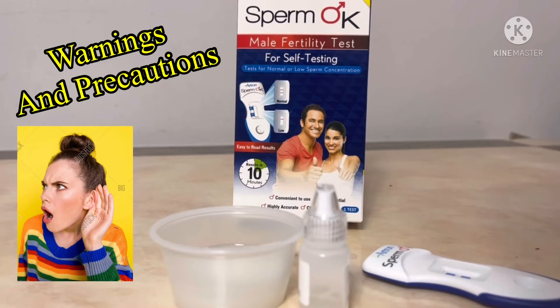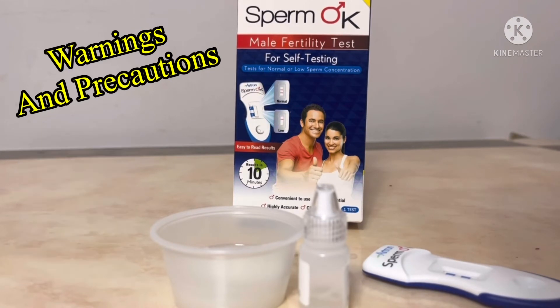Warnings and precautions: do not ingest. Keep out of children's reach. Do not use after the expiration date. Do not use if the product seal is broken. Do not use this test kit with any sample other than those mentioned. Poor vision and improper lighting may affect interpretation of the result. This test is intended for single use only — do not reuse. Package contents may be disposed in normal household waste after use.